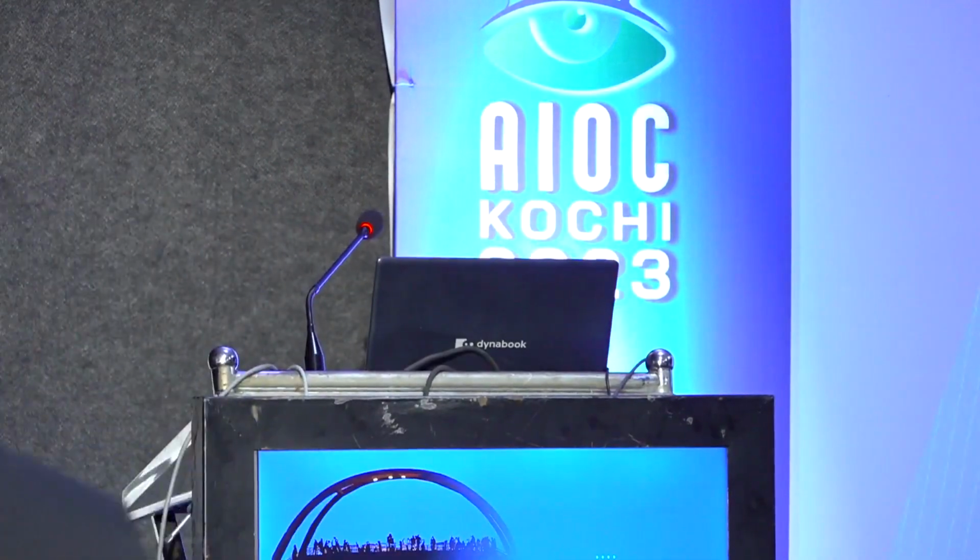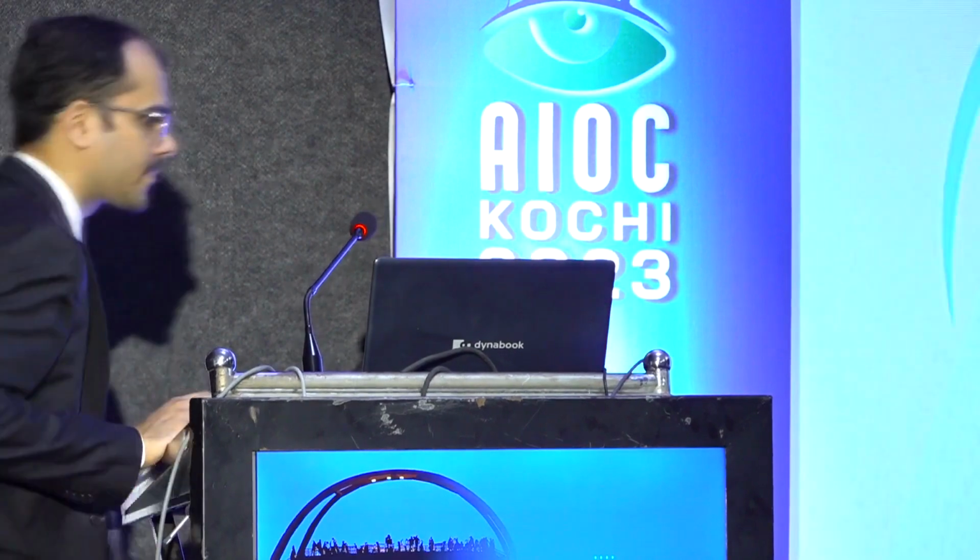Next paper is by Dr. Niroj Kumar Sahoo. Is present. Okay. He will be presenting on en face optical coherence tomography patterns of closure of idiopathic macular hole.